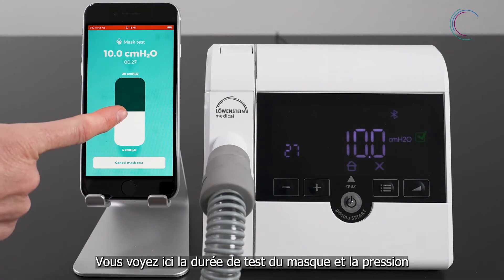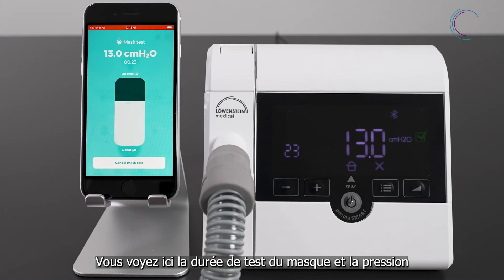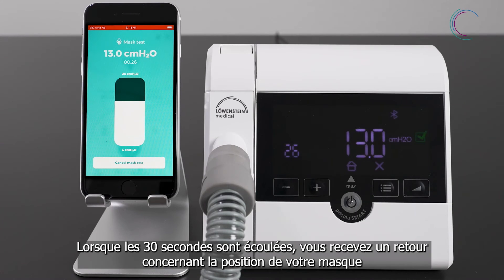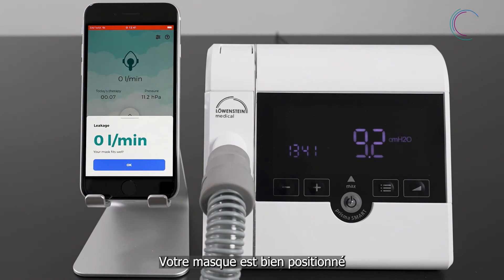You can set the pressure you would like to apply. The mask test will last 30 seconds. After that, you will get feedback on your mask fit. In that case, your mask fits well.